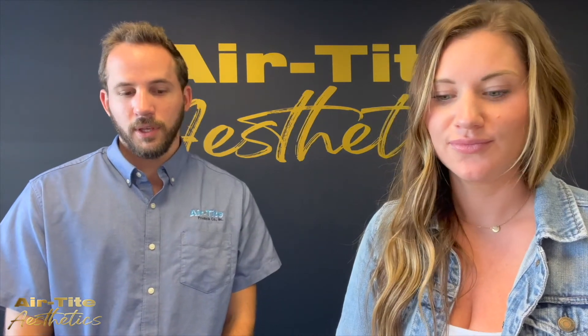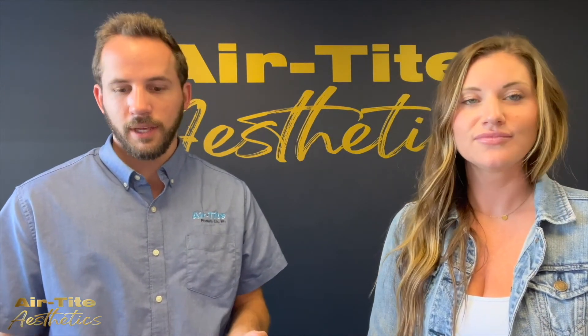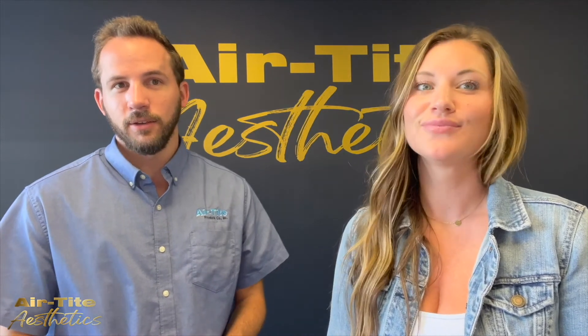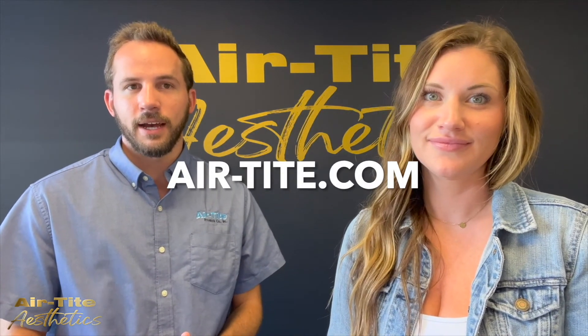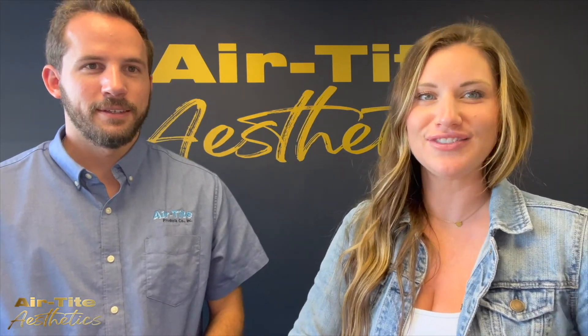You can purchase both the low dead space needles and the invisible needle, which has the low dead space needle hub, from us here at Airtide. You can get them online at Airtide.com. And again, we recommend that you pair them with a low dead space syringe.